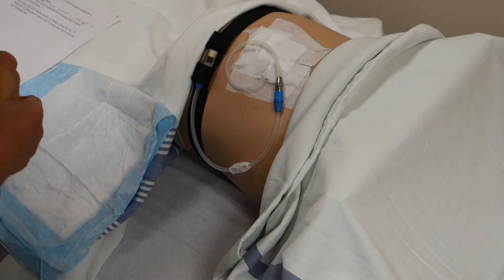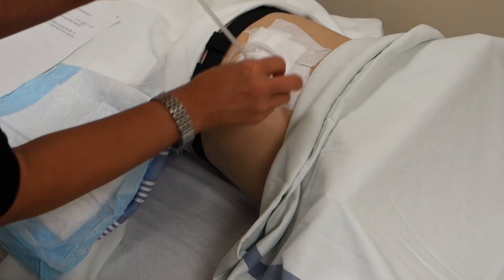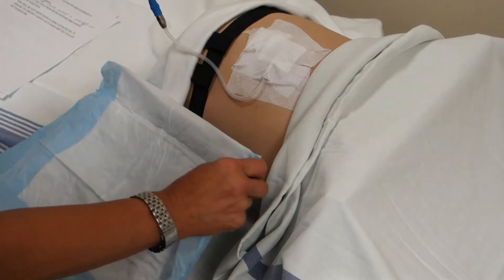Locate your Fresenius catheter extension and establish a clean field with a blue pad.